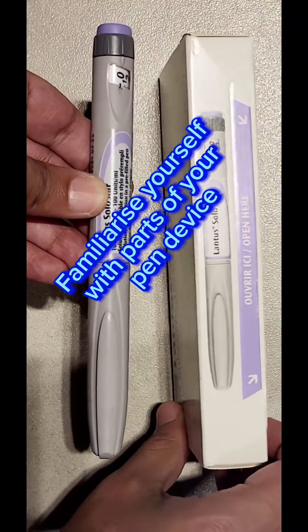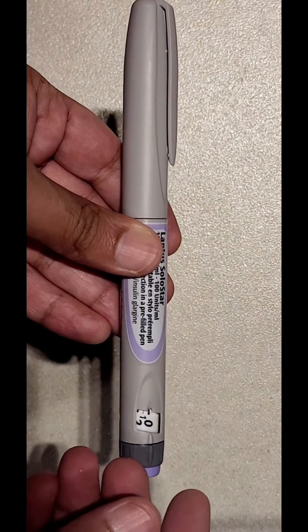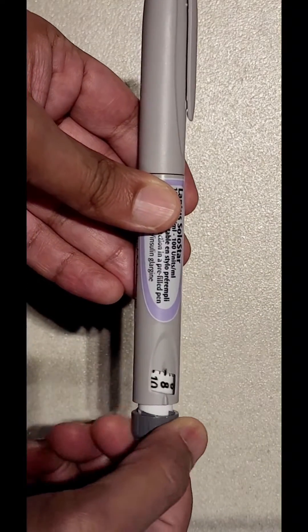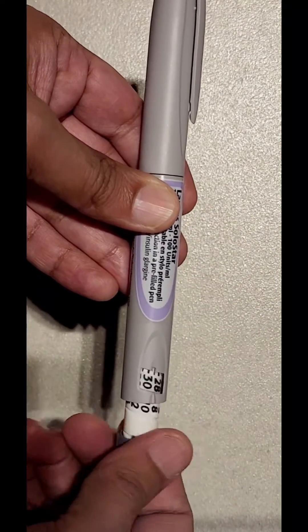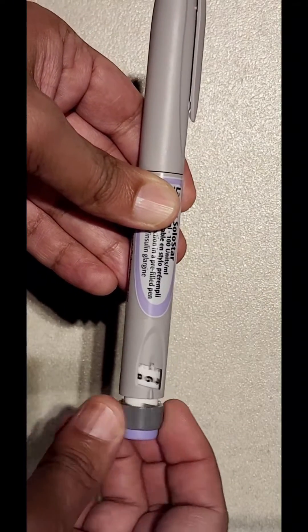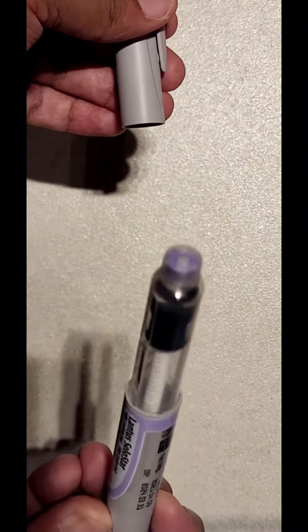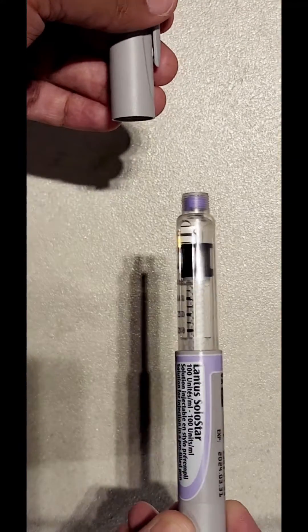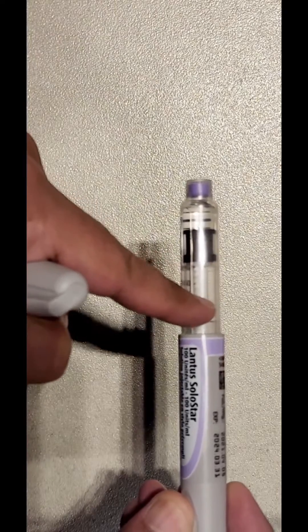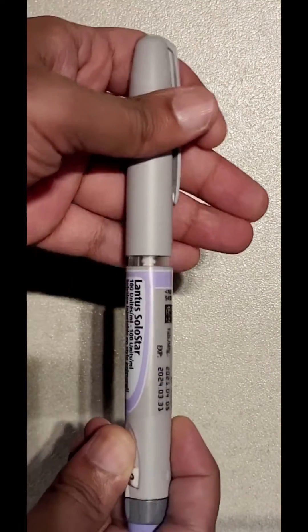Familiarize yourself with the parts of your insulin pen device. The insulin pen device has a dial at the back which can dial all the way up to 80 units. Every unit is heard as a click. The top of the insulin pen device conceals a glass container with a cap. The insulin lies in the glass container and there's a rubber ball on the top. There's a piston in the glass container that tells you how much insulin is left.